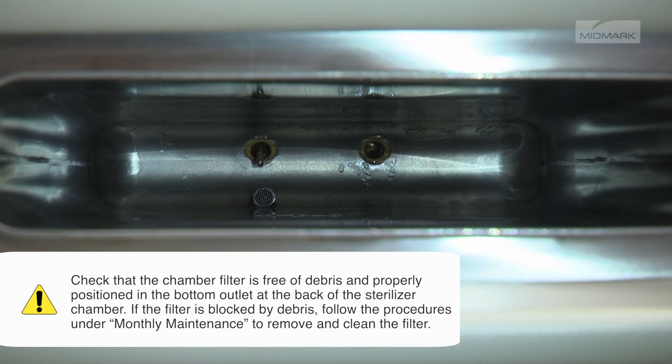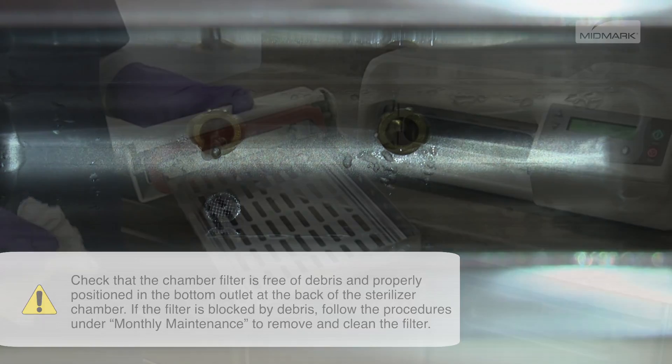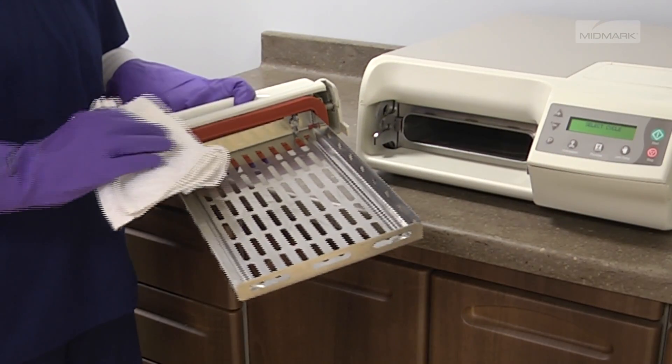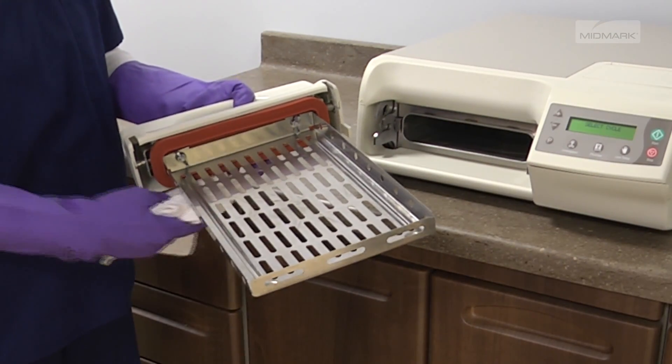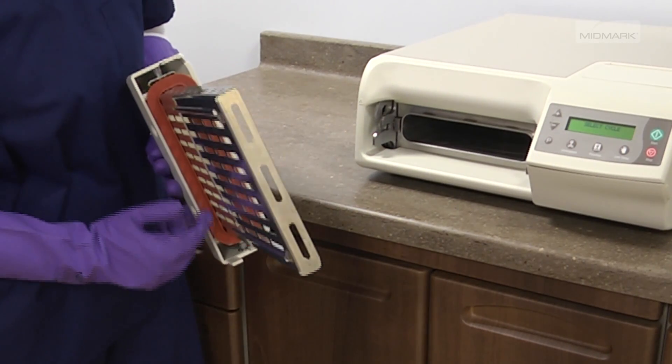If the filter is blocked by debris, follow the procedures under Monthly Maintenance to remove and clean the filter. Wash the door gasket and mating surface with a damp cloth and inspect the gasket for damage. Replace the gasket if necessary.